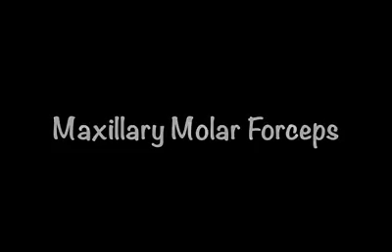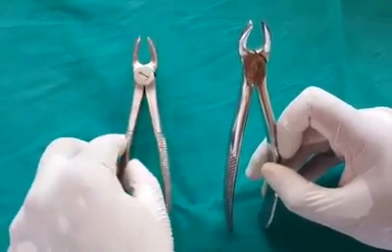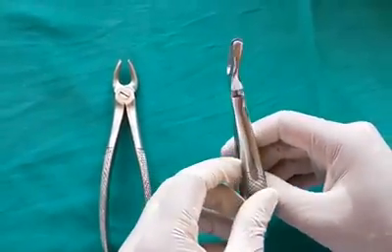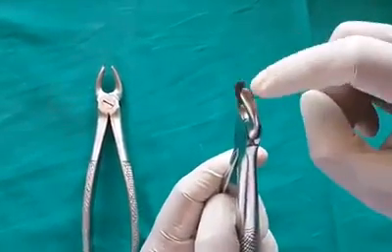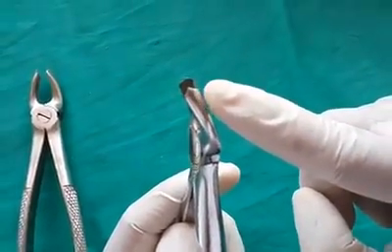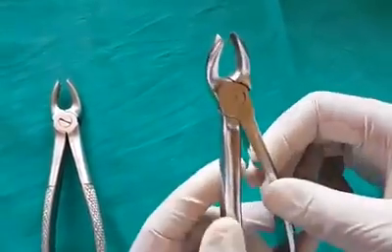Maxillary molar forceps are used for maxillary molars. It is a paired instrument, one for the left and one for the right side. One beak has a pointed end which engages the buccal furcation area, and this determines the side of the forceps. The other beak is smooth and slightly curved to engage the palatal root.